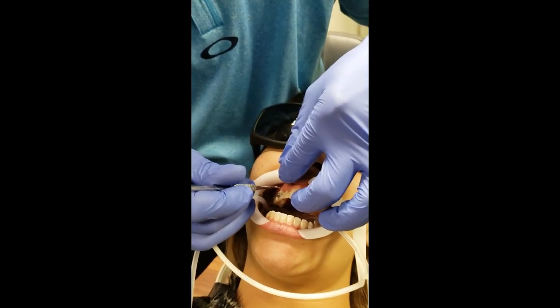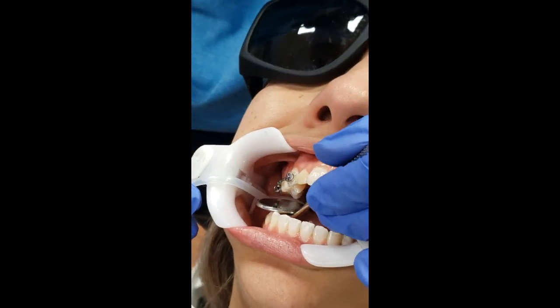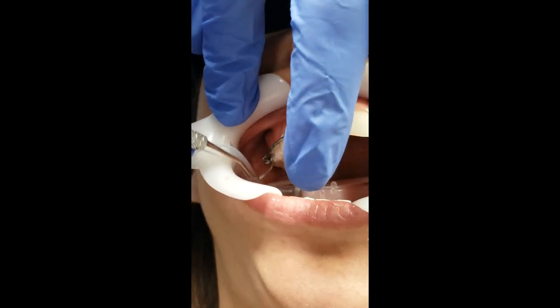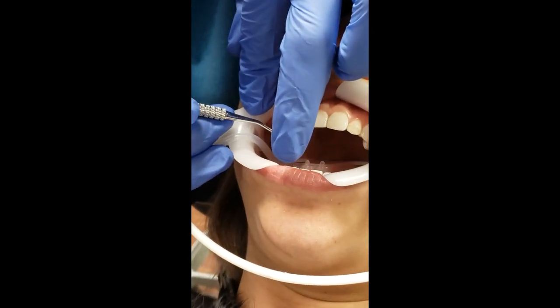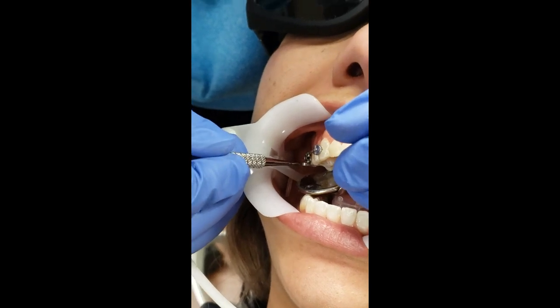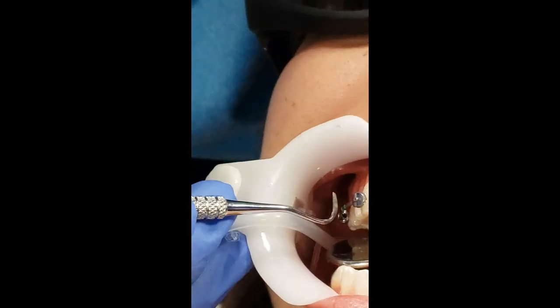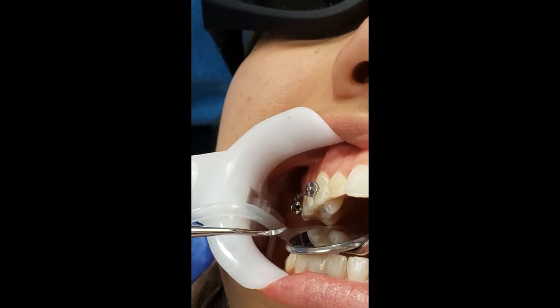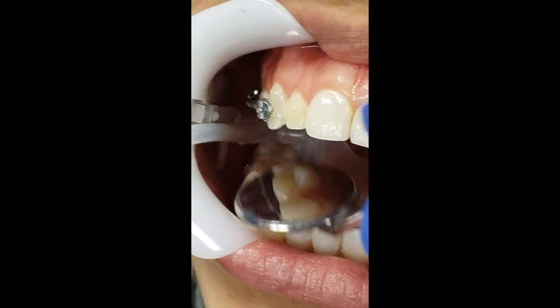Just a little bit of extra adhesive - I'm going to roll it over the edges here. This is really important: you want to make sure that dot is right in that buccal groove. There's no way you can confirm it unless you check with a mirror. You don't want the appliance too close to the biting surface on the molar because they're going to bite it off. Keep it a little gingival, kind of in the center of the tooth.